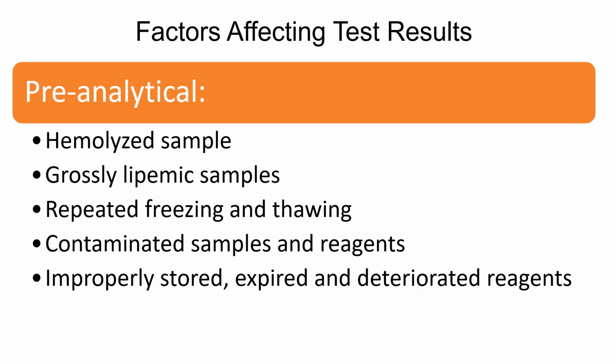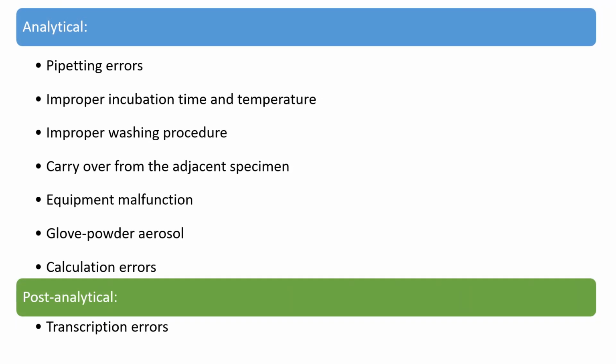In the analytical, there is either error with the pipetting, improper incubation time and temperature, improper washing procedure, or some specimen carryover happened, or equipment malfunction, glove powder, aerosol, calculation errors. In the post-analytical, there is error of transcription.